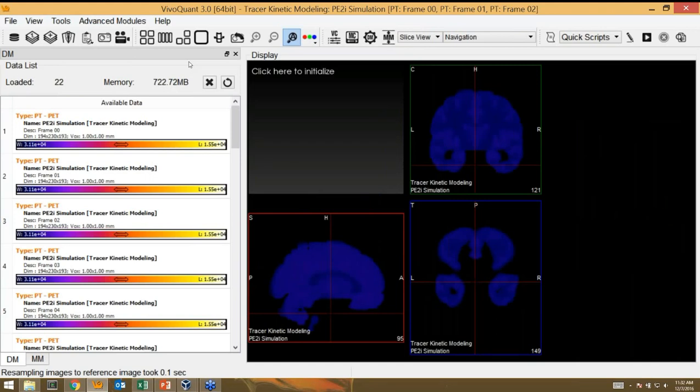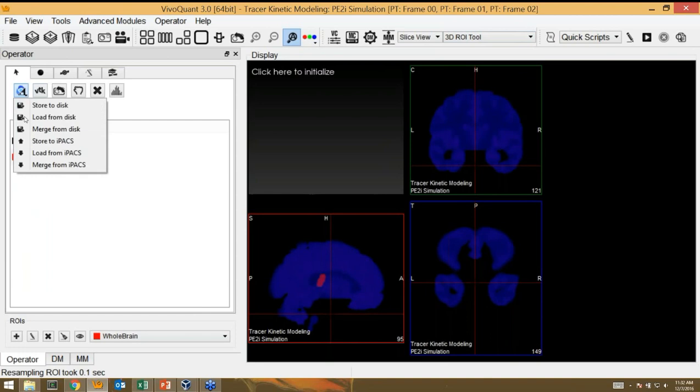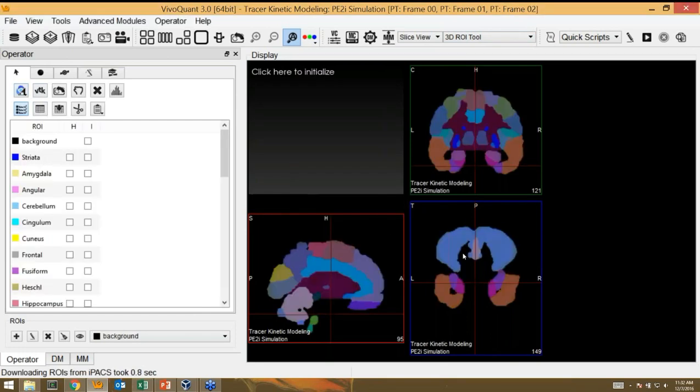And now, really, we've built this tool out to the point where I think it's going to really handle about 80 to 90% of your modeling use cases, including, as I mentioned before, editing or smoothing blood curves, fitting blood curves, exporting information that you need, including information criterion, AIC, BIC, etc. So here, let's just load some ROIs for modeling, which are already available on the IPACs.